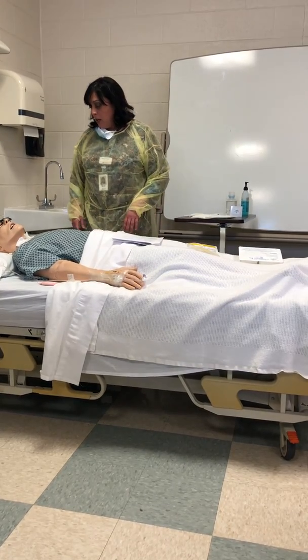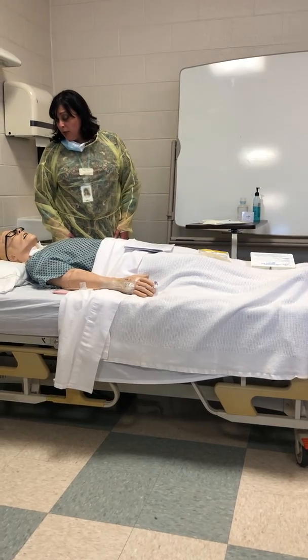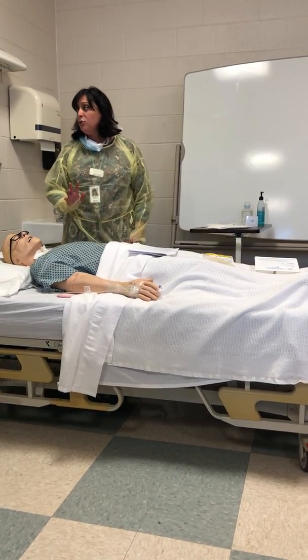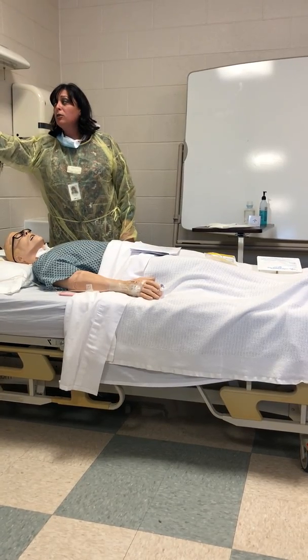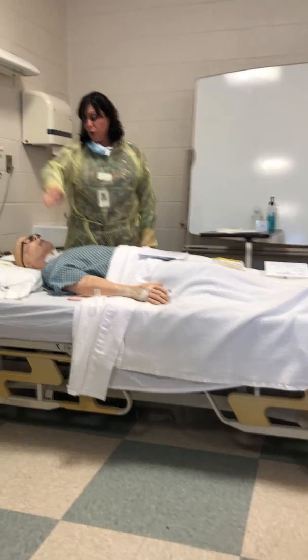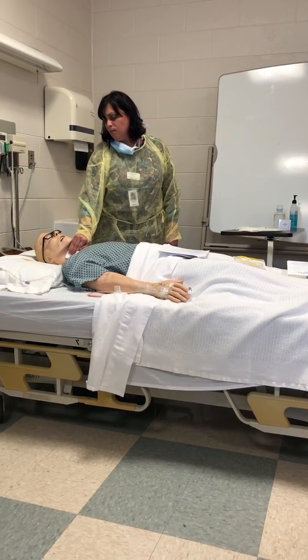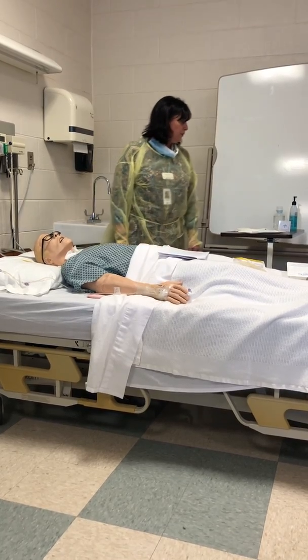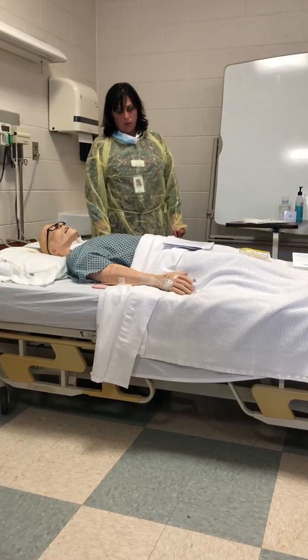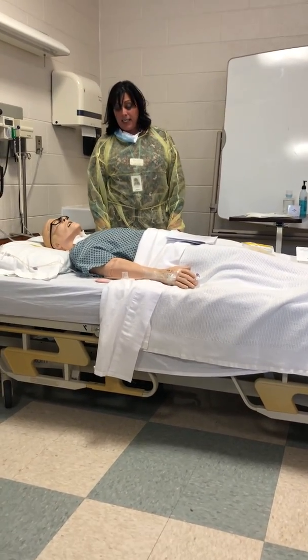Okay, all right, this is what we're gonna do. I already told you about it. You sound like crap. You're ready for it. Good. So we're gonna get to suctioning on you. Before I suction you, I'm gonna turn my oxygen all the way up. My little ball's gonna be up to the 15. I'm gonna hyper-oxygenate him. You take a couple of big deep breaths. Take that oxygen. Good. Real good.